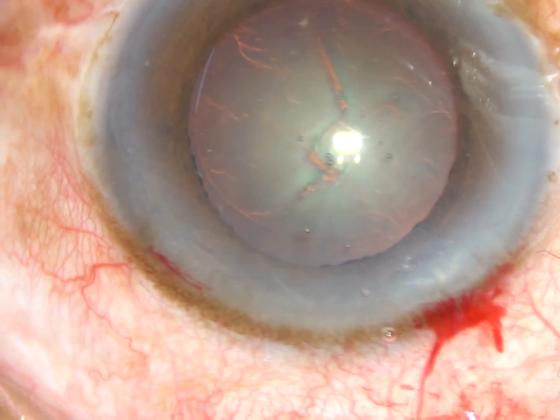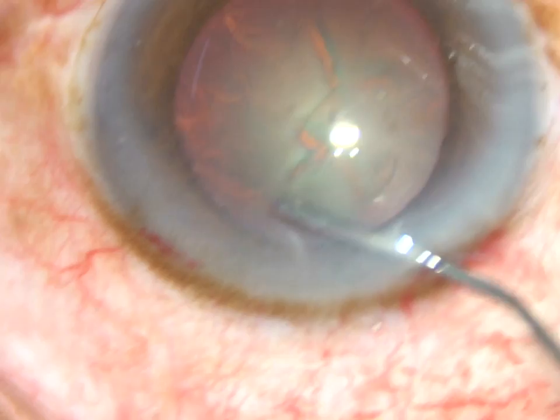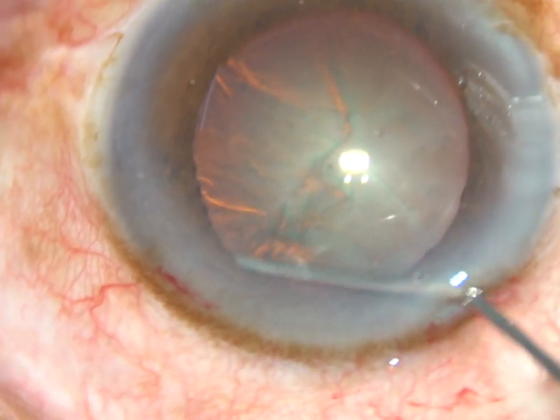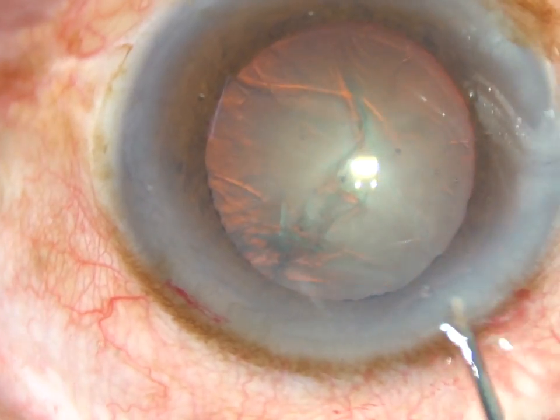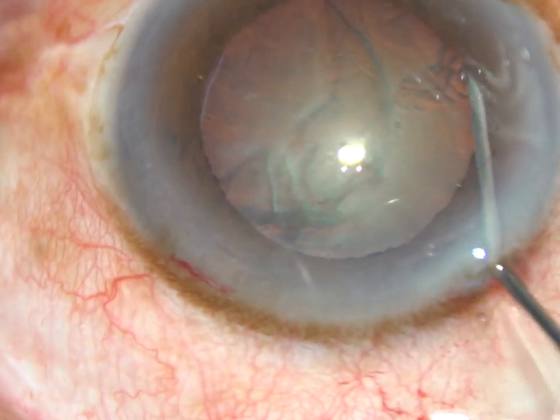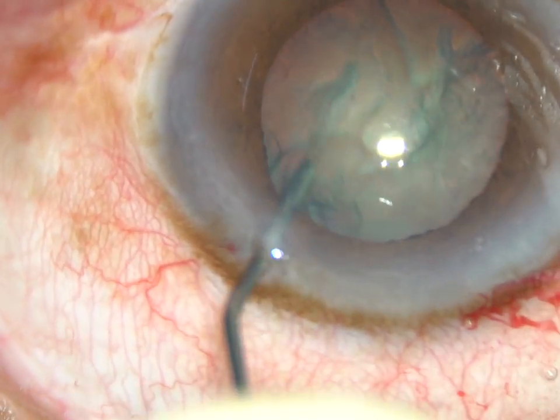BSS is passed just underneath the anterior capsular rim and the fluid wave goes to the opposite equator. Now the nucleus is rotated.